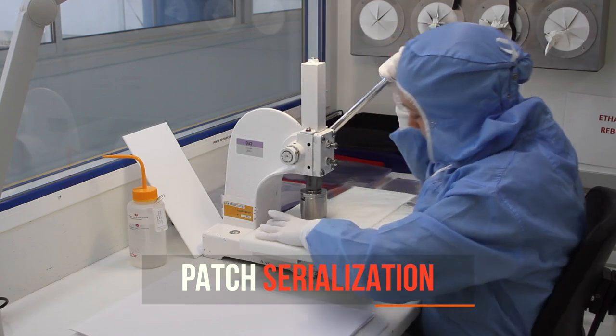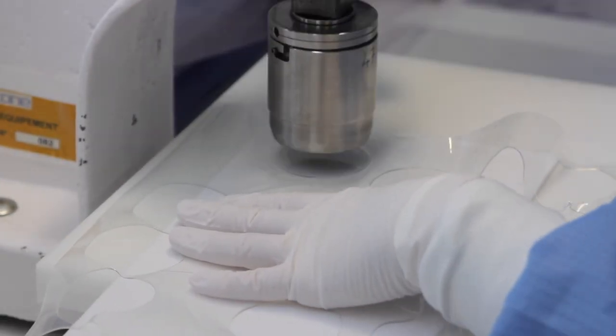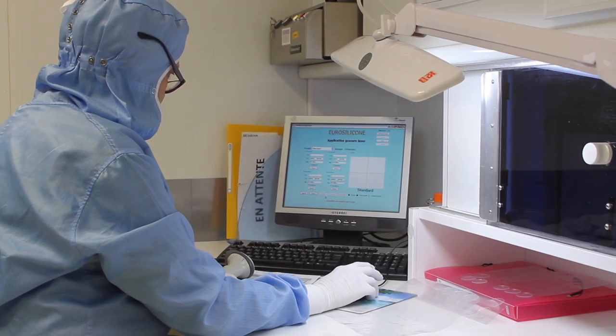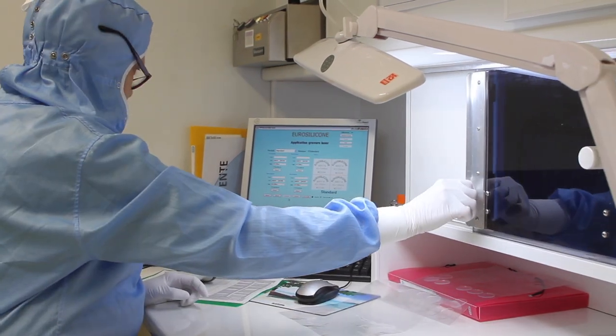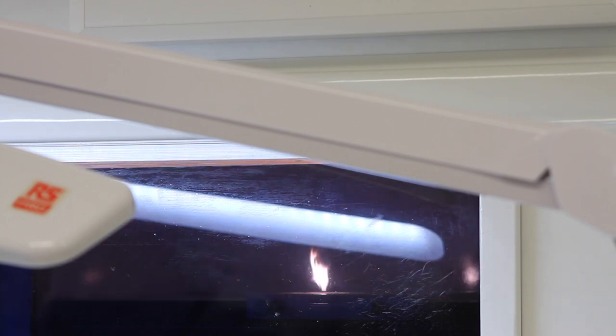So as you can see here, the shell is empty and we have a hole behind the shell. So the main objective of this step is to close the shell with a patch. And this patch has been serialized through a laser in order to have a unique serial number on the breast implant.